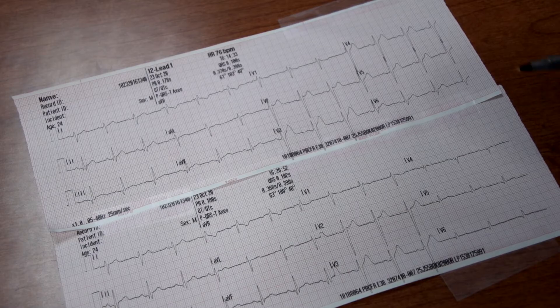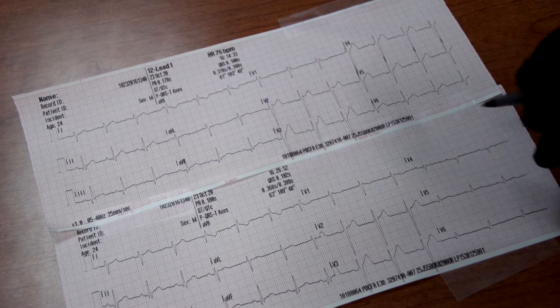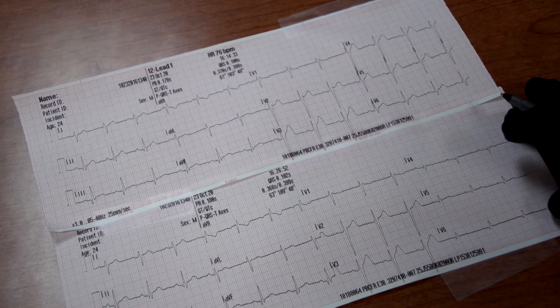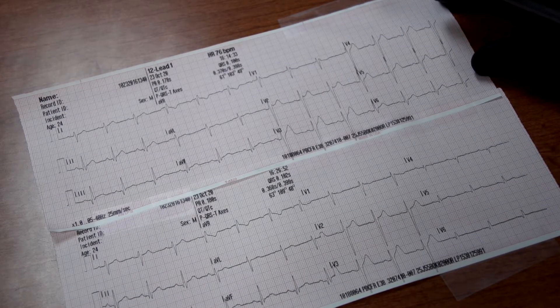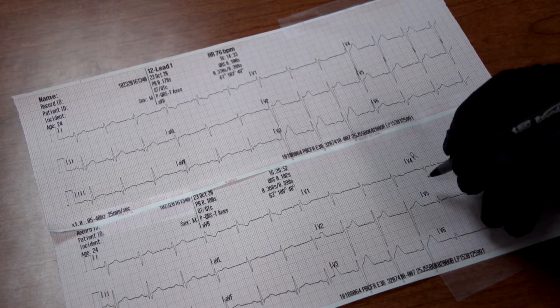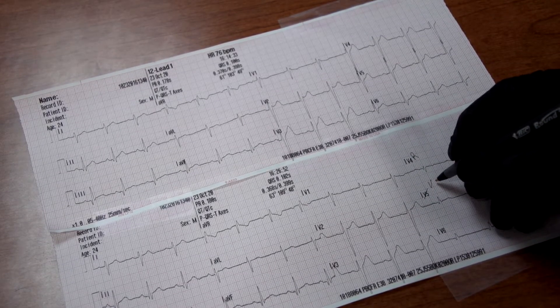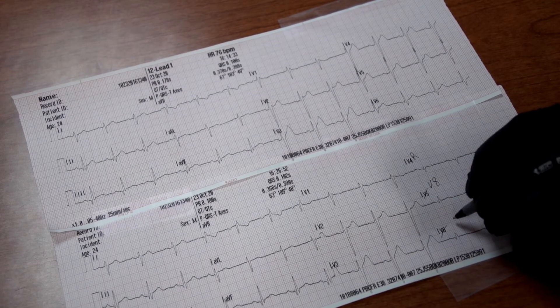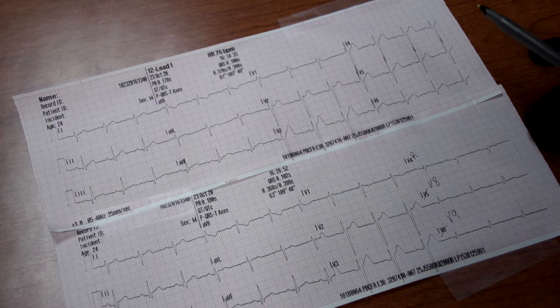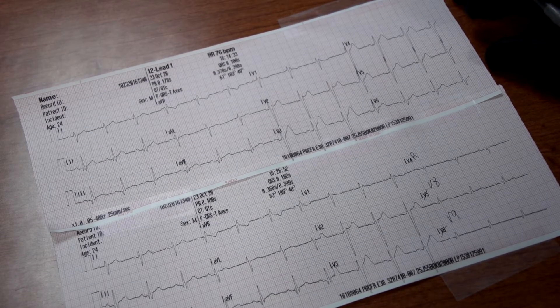We're going to relabel these so that when we turn this over to the hospital, they'll know which is the 15-lead and which is the 12-lead EKG. We're going to label this as V4R, scratch out V5 and write V8, scratch out V6 and write V9, so that everybody knows this is the 15-lead and this is the 12-lead.